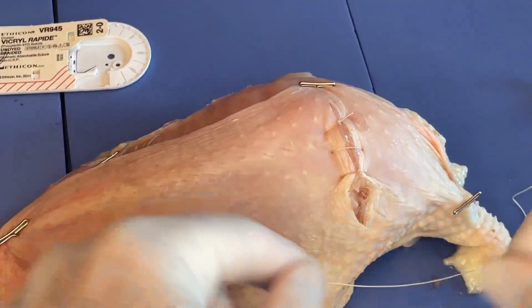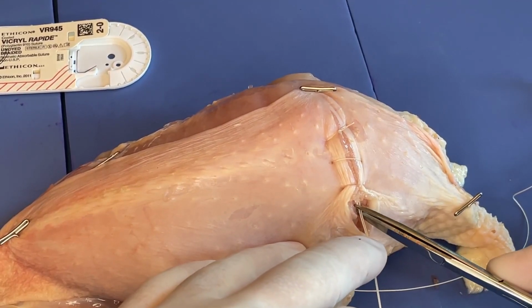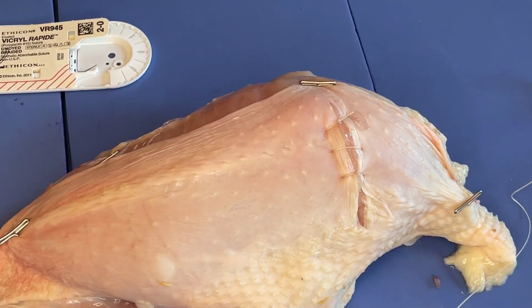Finger, 4 throws for vicryl to complete square knots. Yeah, so we've got that buried knot. I think I might have locked that a bit.